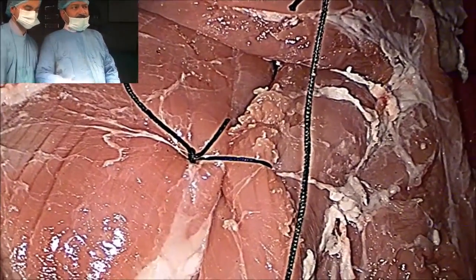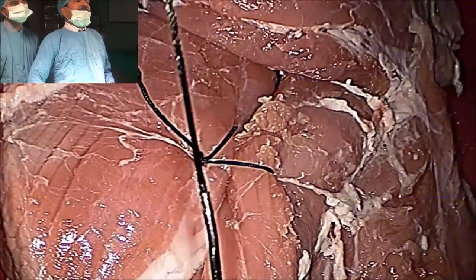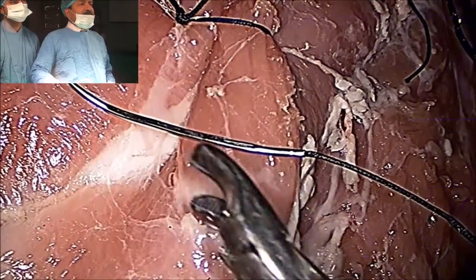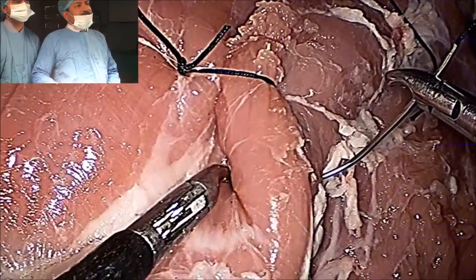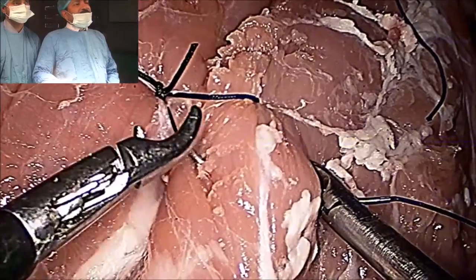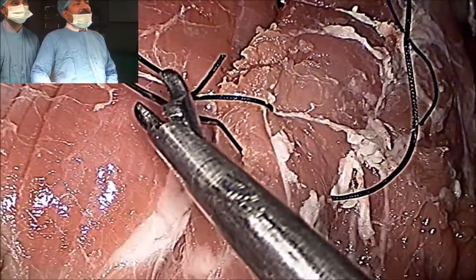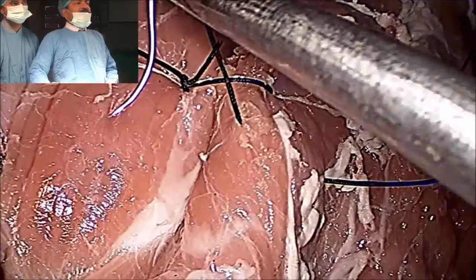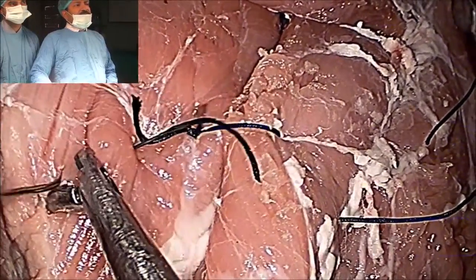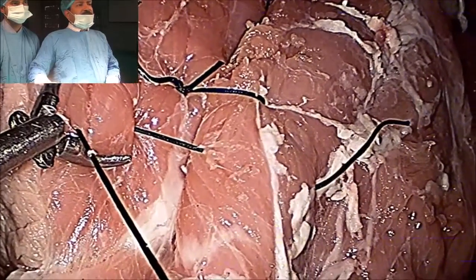I will show you once more time how to tie the tumble square knot. You will hold the needle and drop it in such a way that the tip should be left and the tail should be right. Then you will press by the upper jaw and it will get erect up. Suppose I am taking one bite at this point — turn the Maryland, catch the tip, guard the tissue, take the needle out and immediately catch the needle, don't drop it. Then take the bite — suppose I am taking far away at this point and I want to approximate these two edges. In those situations, surgeon's knot is not possible because there is a lot of gap over the tissue, so you will tie the tumble square knot.